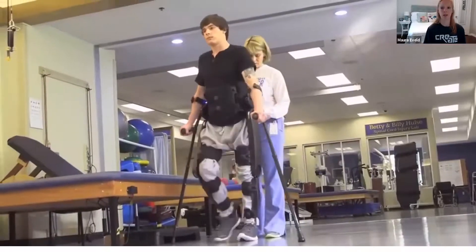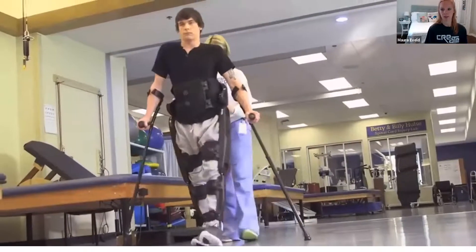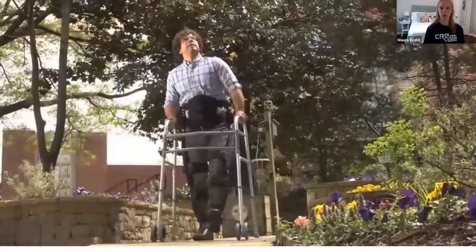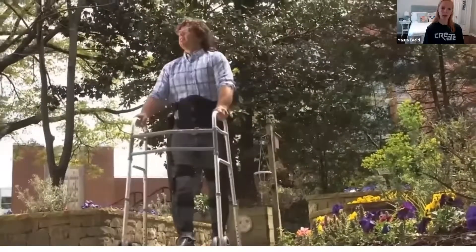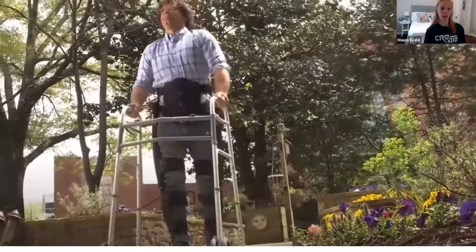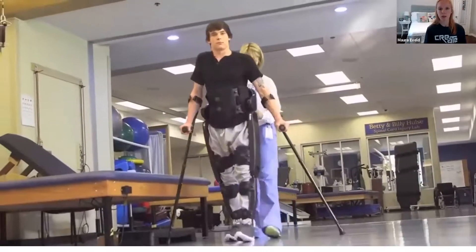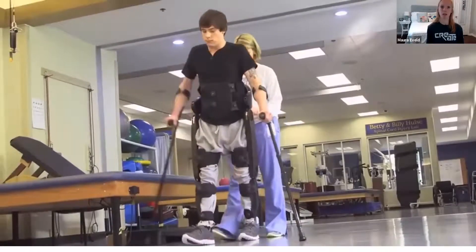Next, we have an example of a powered lower limb exoskeleton. This device is intended for individuals with spinal cord injury, meaning they are paralyzed from the waist down. The device can actually stand and walk for the user using motors at both of the hip joints and both of the knee joints.